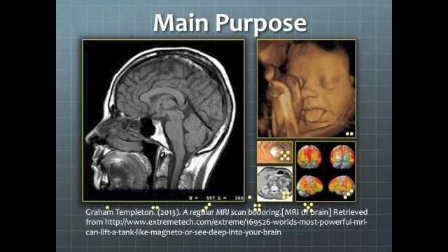The main purpose of PACS is to replace hard film copies with digital images to make it easier for medical professionals to manage patient exam workflow. PACS handles images from various medical imaging instruments like ultrasound, magnetic resonance imaging, positron emission tomography, computed tomography, endoscopy, mammographies, and computed radiography.